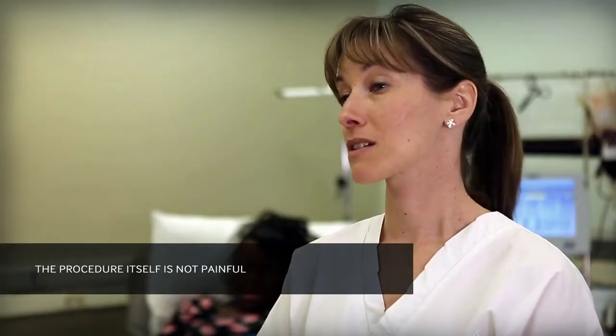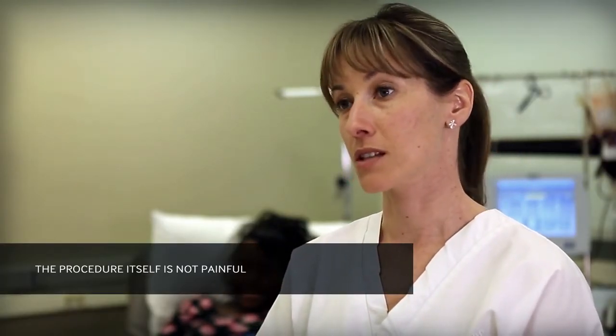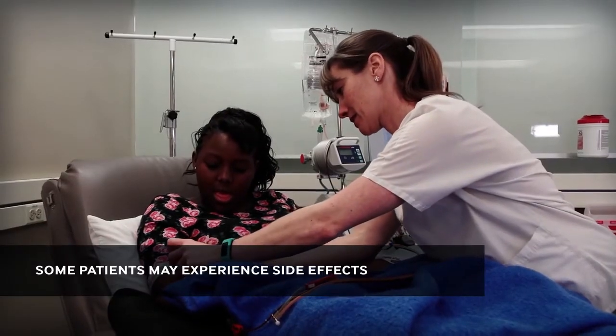While some patients may experience slight discomfort when the tubes are connected, the procedure itself is not painful. Bruising may occur depending on how the patient is connected to the system. Some patients may experience side effects.